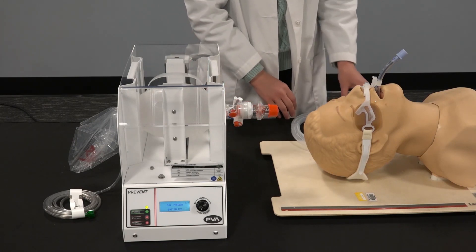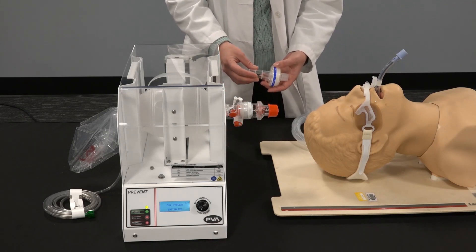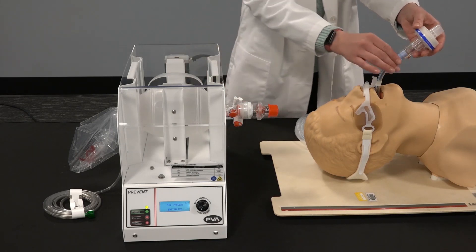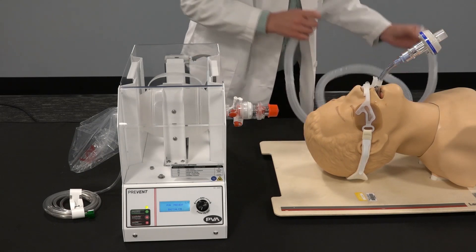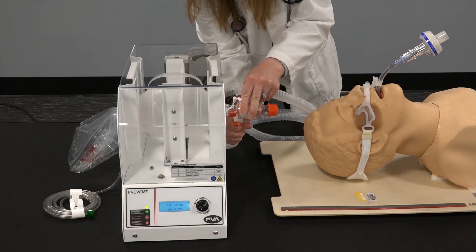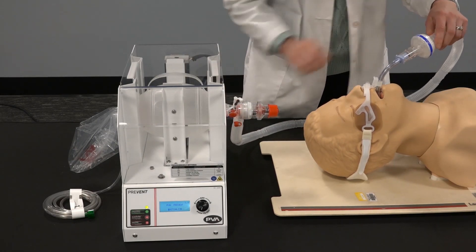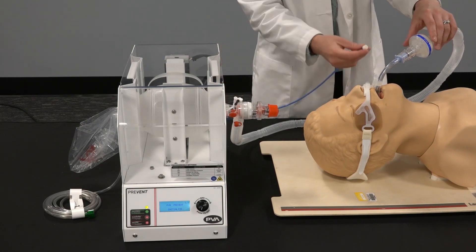In this tutorial we are using 10. Next, attach the heat moisture filter and the adapter to the end of the endotracheal tube tubing. And last, the pressure sensor.